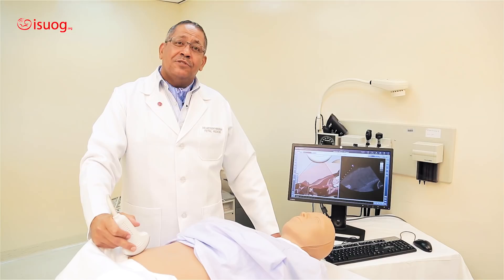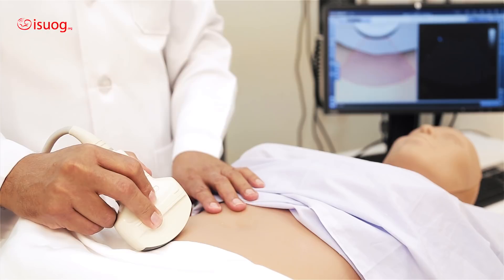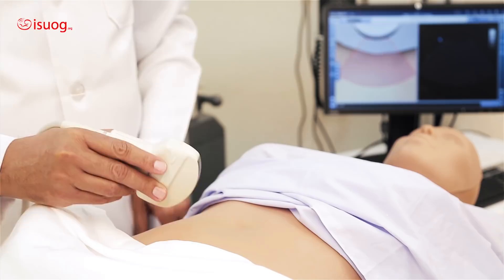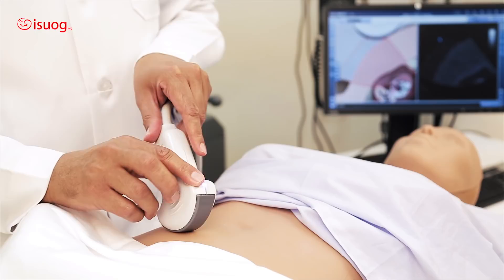There are three ways of doing this. The first is to look at the front of your probe — there is always a mark. This could be a protrusion, a colored line, or even sometimes a light. This mark should always be facing toward the patient's face.